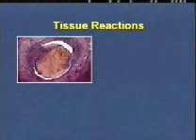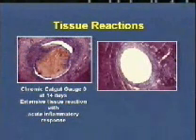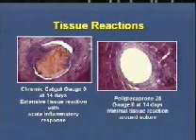As with any implanted foreign body, a suture material may elicit biological responses during the first post-operative week. While most materials will cause a mild reaction, synthetic materials tend to be less reactive than natural fibres. The chromic catgut sample shows extensive tissue reaction with an acute inflammatory response, but this is no longer in use. Contrast this with the minimal tissue reaction that occurs with polyglycaprone, which is a replacement for chromic catgut.